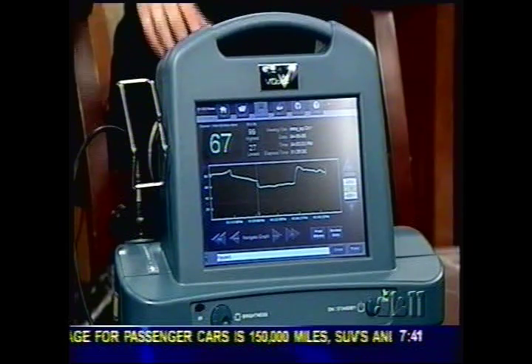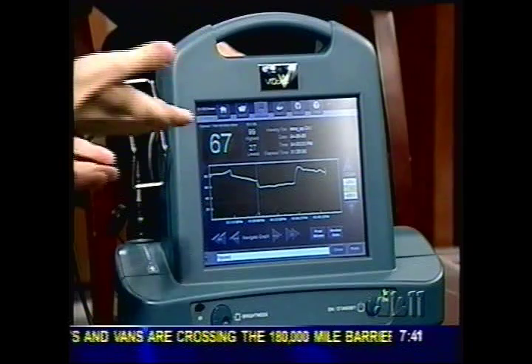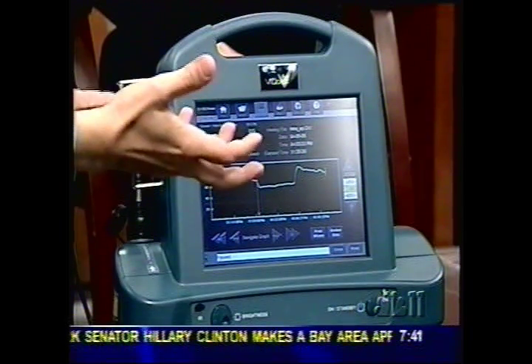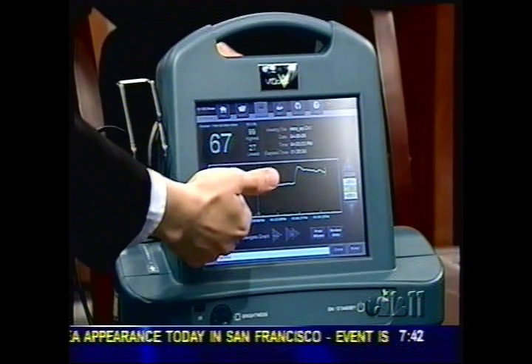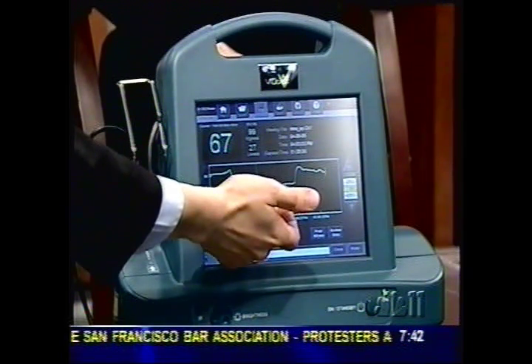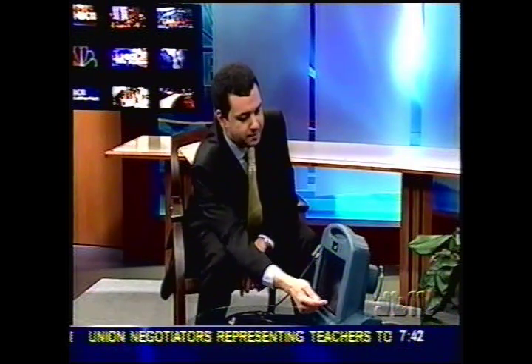Okay, now you can't show us exactly how the device works, but you do have some data here from one of your patients. Explain what that is then. Yes, so this is a typical use. Actually, this is an actual patient data where this device has helped avoid a complication, essentially. So as you see here, during the surgery, the oxygen is measured and it looks pretty high. This is pretty normal. And then the doctors started seeing that the oxygen started going down. What happens after is that they've done something. Essentially, they unclogged the pipe and the oxygen went back up.